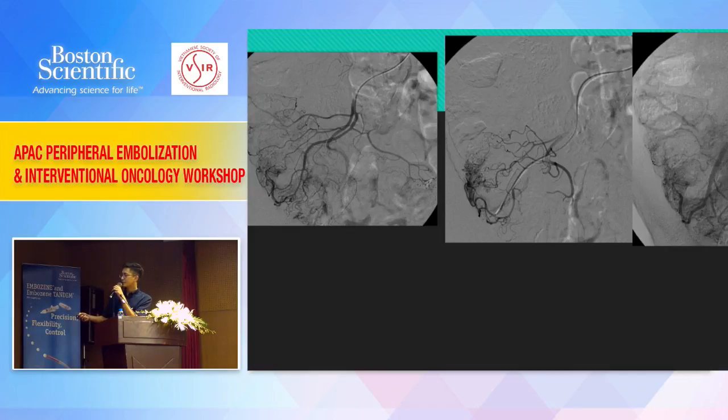More selectively, we see some draining vein. It's quite early phase, so there are some possibilities for diagnosing the patient. The most likely is angiodysplasia, and maybe it can be a hypervascular tumor, or AVM. So anyway, we have to occlude this lesion to stop bleeding.